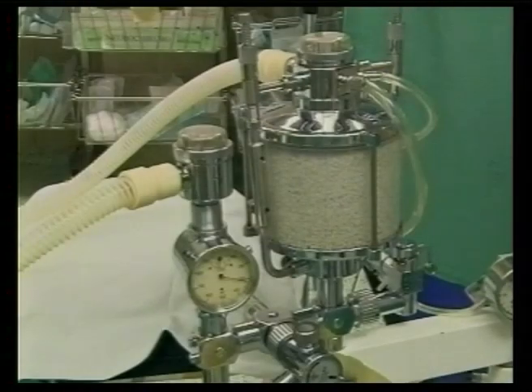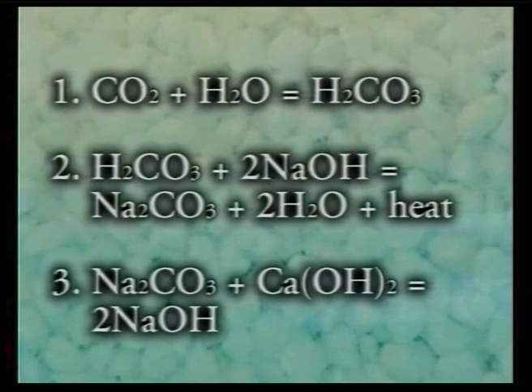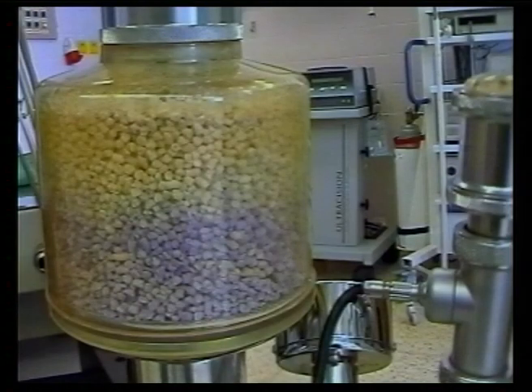Carbon dioxide absorber is filled with soda lime. Soda lime is used as it absorbs carbon dioxide and it is partly able to regenerate. This is shown in the third equation. During the reaction, heat and moisture are produced, helping to warm up and moisten the mixture to be inspired. The exhaustion of the capacity of the absorber is signalized by a color change. This agent turns blue, others can turn, for example, pink.